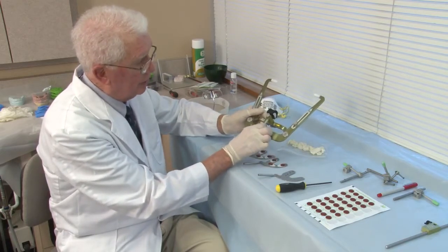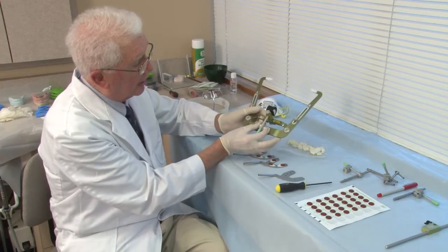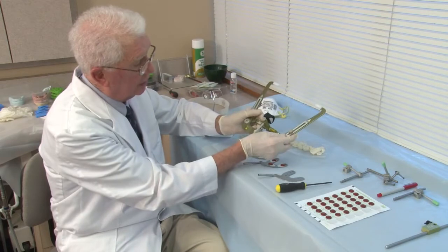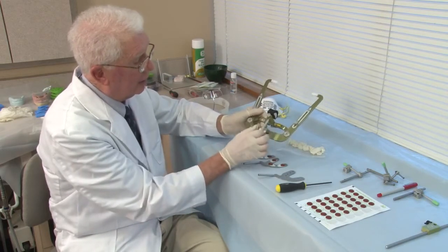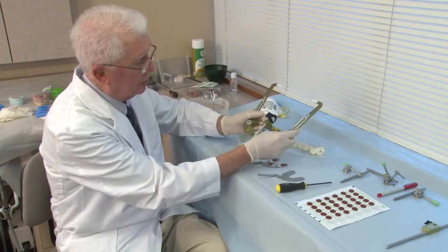To actually make a movement of the ear bow, to change it, only requires about a quarter of a turn. See, just that much, and I can move it. So don't make it real loose, just a little quarter of a turn, and you can adjust the width.